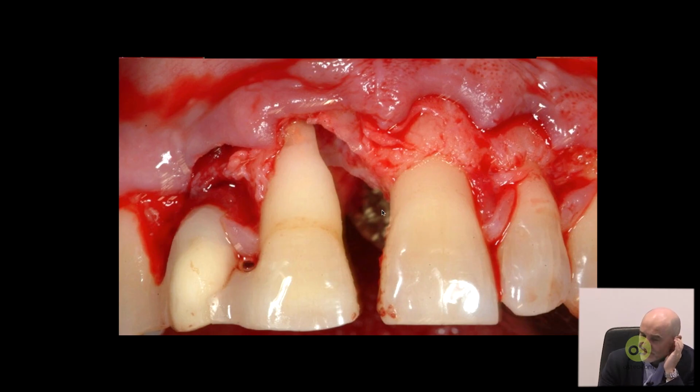If you consider the adjacent papilla, and if you consider that at the level of the adjacent papilla with respect to the defect, we make a submarginal incision in order to create a split thickness papilla at the buccal flap, there is a remaining anatomic papilla that can be disepithelialized.